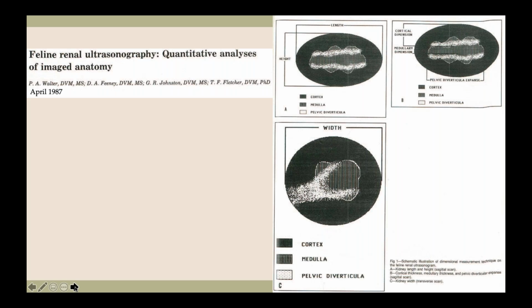I will say, full disclosure, that I do not do ultrasounds. I will frequently do just bedside scans on my patients, looking at their kidneys, looking at their urinary tract with our bedside ultrasound. I'm always then sending them up to our radiologists who are using the really good ultrasound equipment, and they've been properly trained. So I'm not the one who's making the final call on diagnoses via ultrasound.